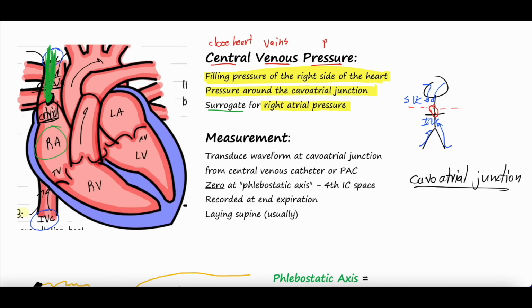That's what it is. And if you have a lot of blood in a pipe, you're going to have a higher pressure in that pipe. If you have just a little bit of blood in that pipe, you're going to have a lower pressure in that pipe. The plot's a lot thicker than that, but it is a simple way to get a foundational understanding of what exactly this is.